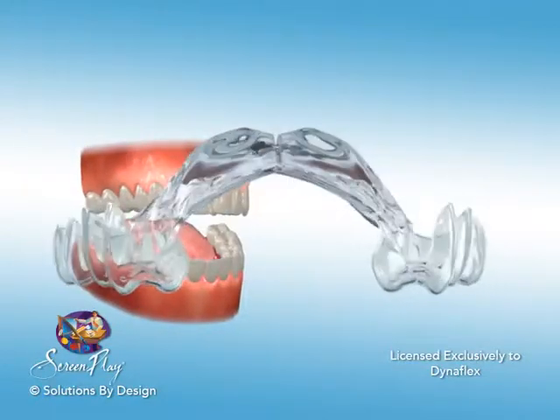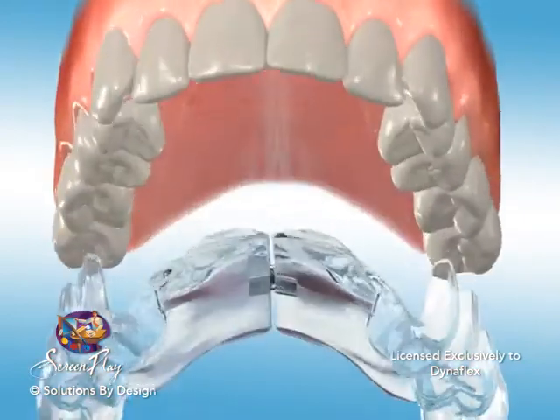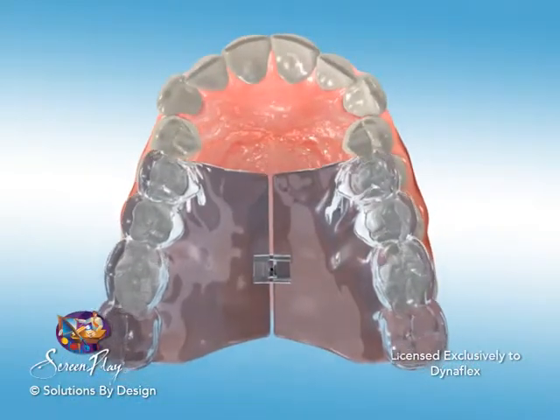A small screw separates the right and left half of this appliance. The screw is expanded to create the force to widen the upper arch and to create space.